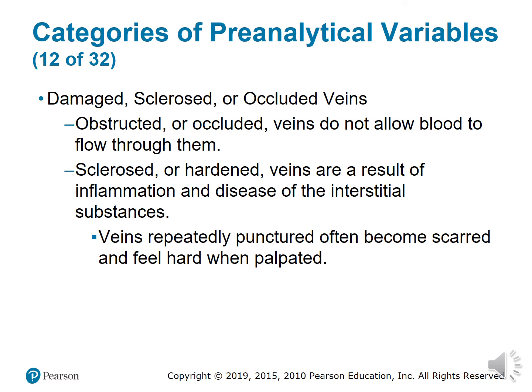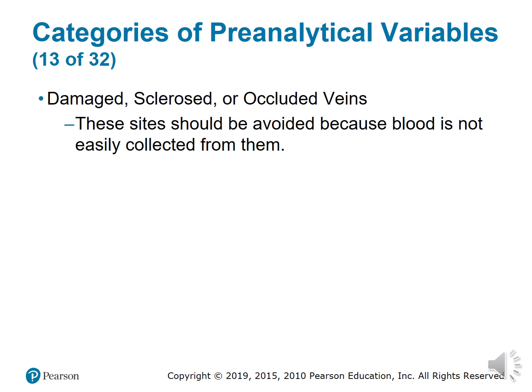In those cases, a re-stick may be warranted, so you just have to be mindful of that. These sites should be avoided because blood is not easily collected from them.